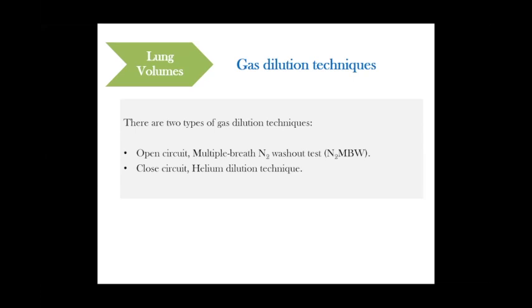The other test is the closed circuit helium dilution technique, in which we give the patient helium and ask him to breathe in and out until equilibrium is maintained between his lung and the machine.